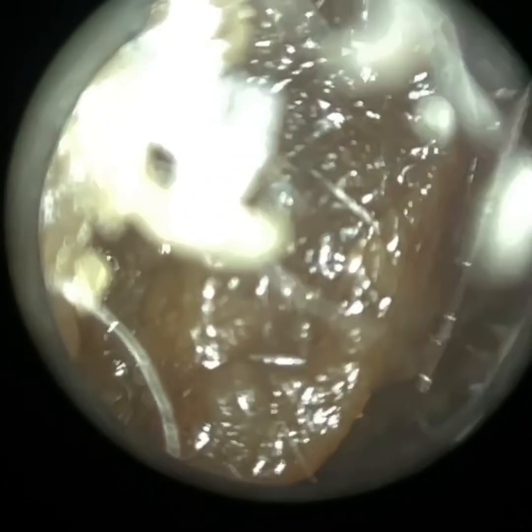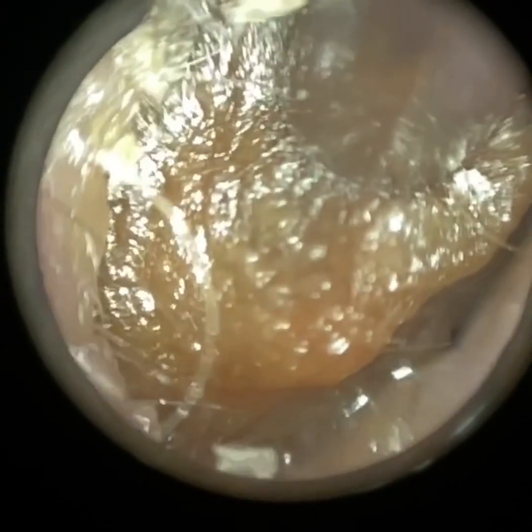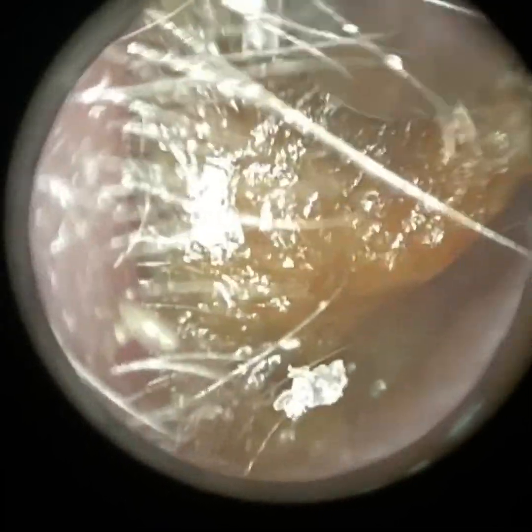Just moving on to this patient's right ear now. I think this ear was a bit narrower, but once again I'm using our medium-sized specular. I'm using the left-hand side of the specular to push open the first bend — so when we push open the first bend from right to left, you're somewhat straightening the ear canal. Again, the surface of this plug is quite dry, but at the bottom I think either I have or this patient used some drops prior. You can see there's a bit of drops at the bottom of the ear canal — it's just trapped, trying to bring this forwards, but it's trapped in that isthmus I explained in the patient's left ear.